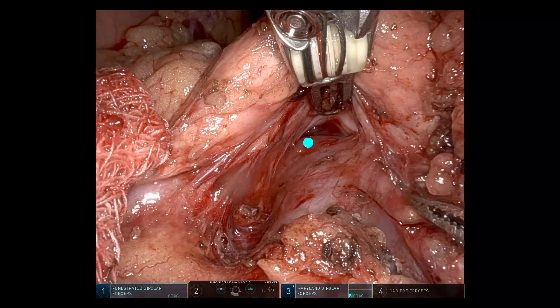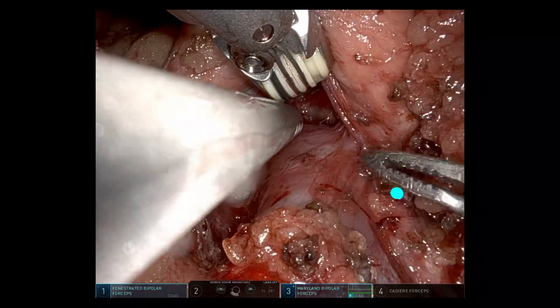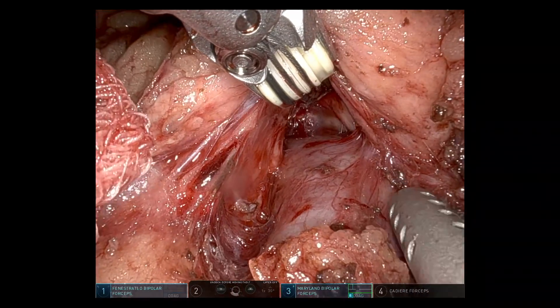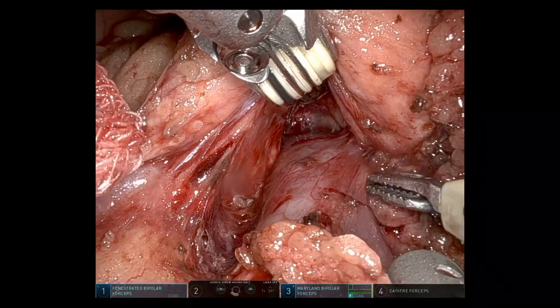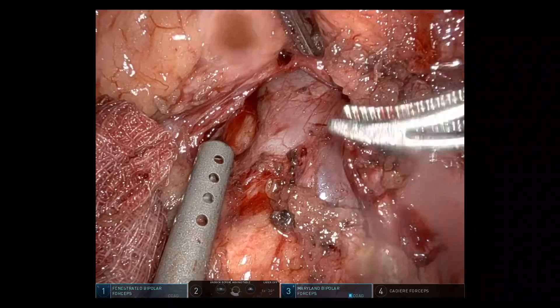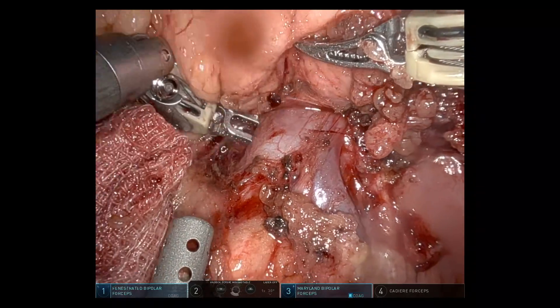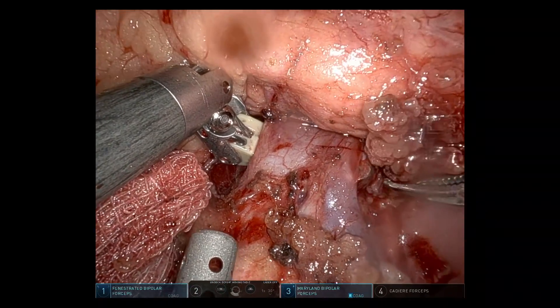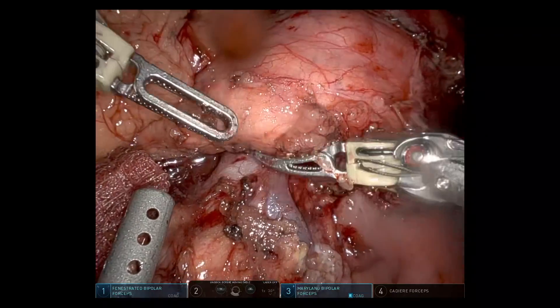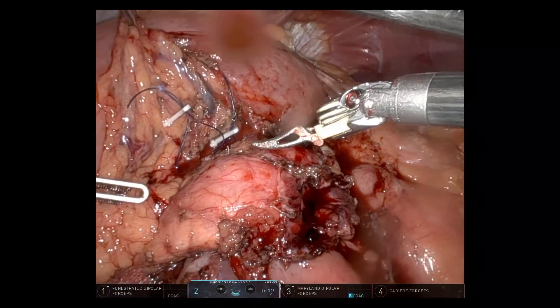Going back to that tunnel before dividing those vessels — you can see the splenic vein is being drawn up into the tumour. Going around the SMV now with a double rubber sloop. The stability of the robotic platform, the 3D view, and the stable camera are really helpful when dissecting around these fairly large vessels.